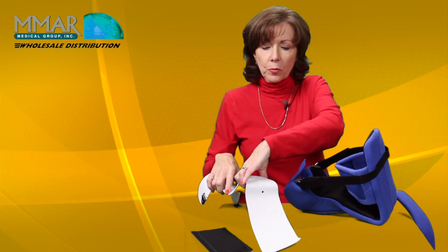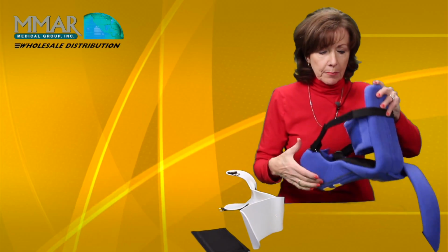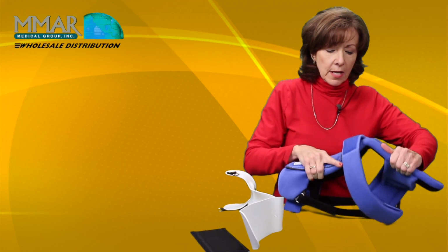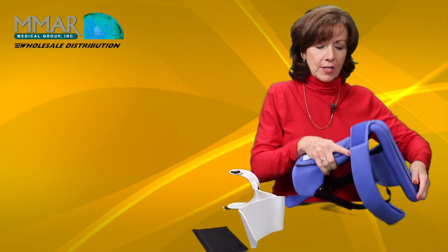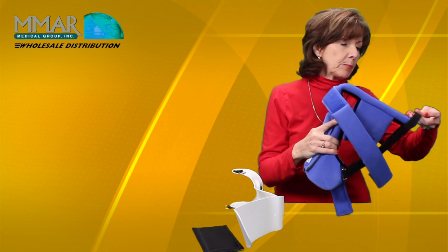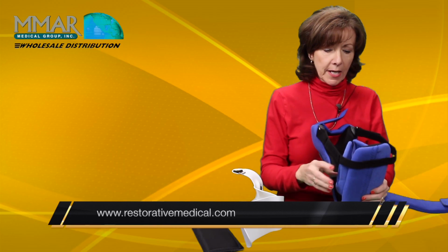Also, we show you on the website how to put the padding back on, and that's very simple. One of the key parts is that when you put it on, you flatten out the boot so this just velcros together like you would be zipping a garment. It makes it very simple, but do refer to the website. Those videos are there to help you.